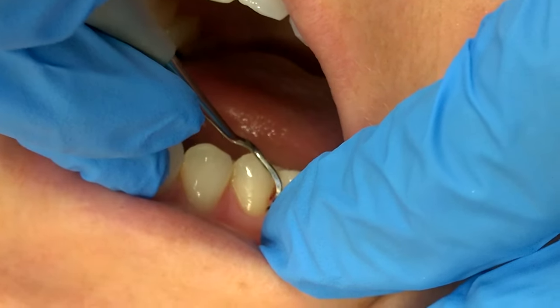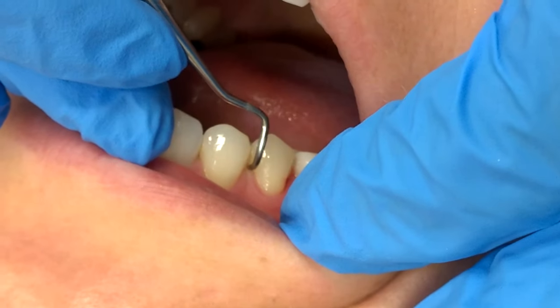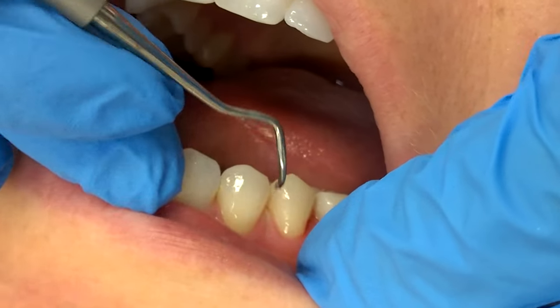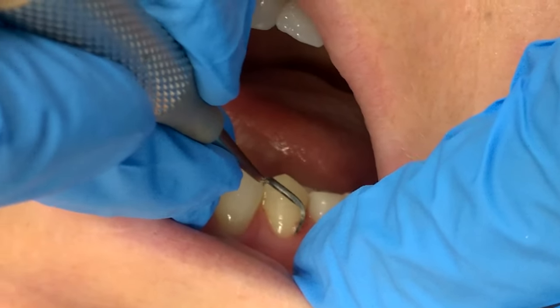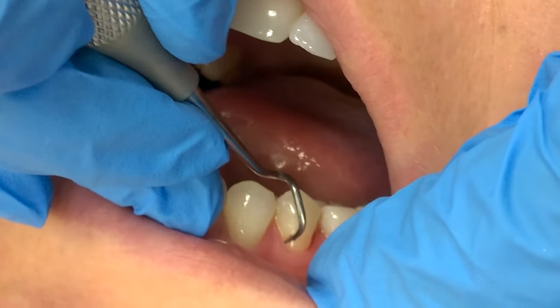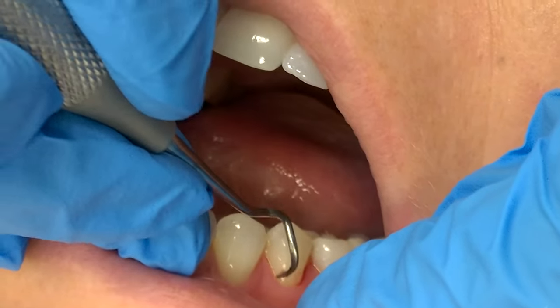Then if you start right back here at your line angle and come all the way around, adapting right into that mesial. And then to do your horizontal strokes, just come and point that tip right towards the apex, right towards the gingival sulcus, to do your horizontal strokes.